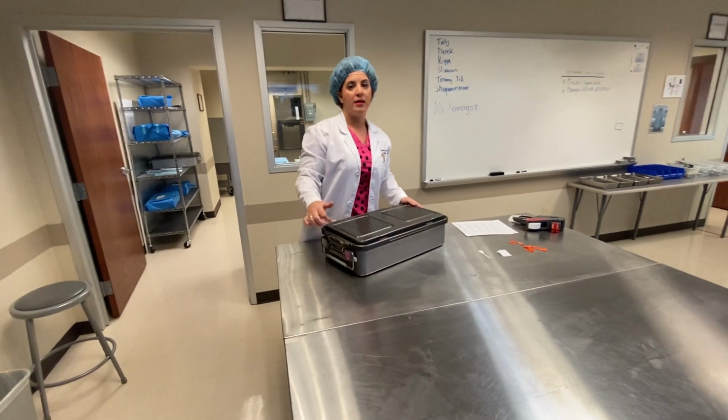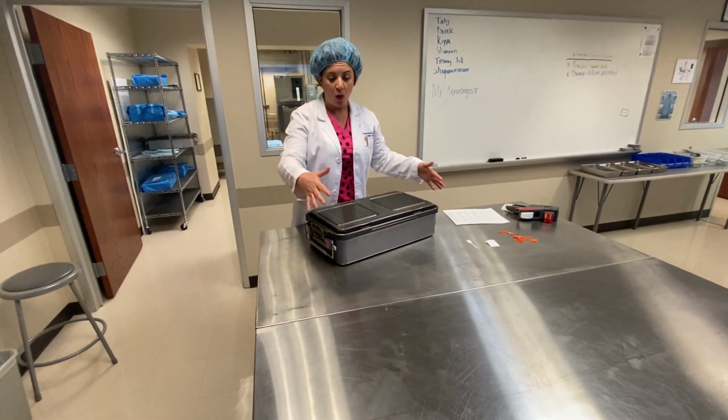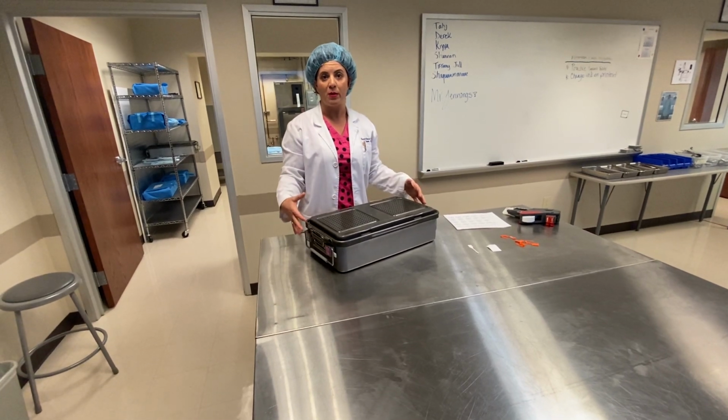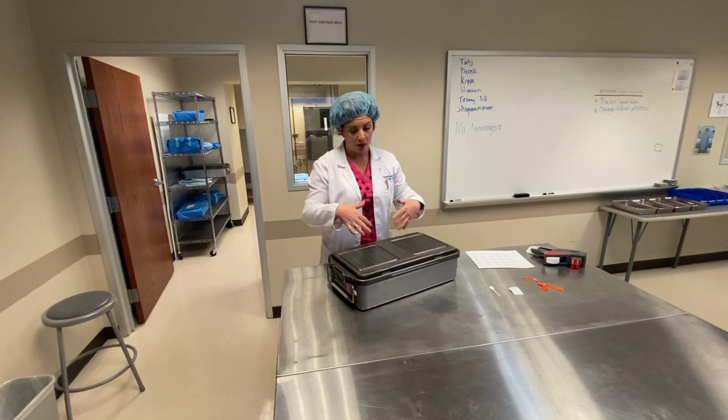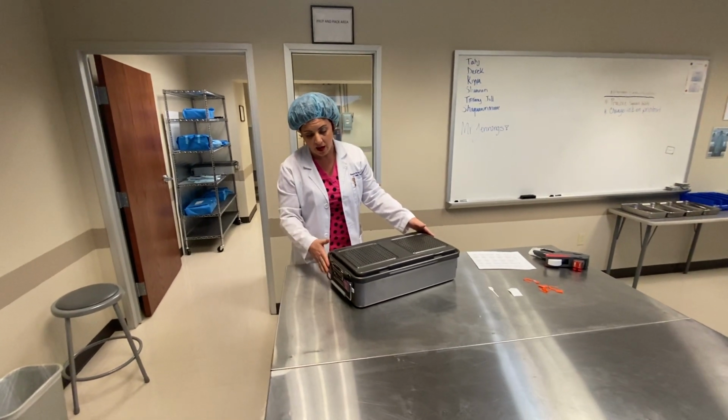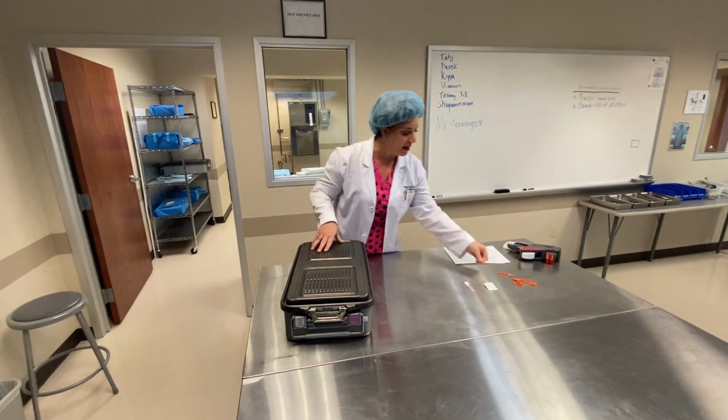And we talked about event-related sterility, where once part of the integrity is compromised, then that tray would have to go back and be re-sterilized. So at this point, we got our locks in. That's good. There's a couple other things that we need to do.